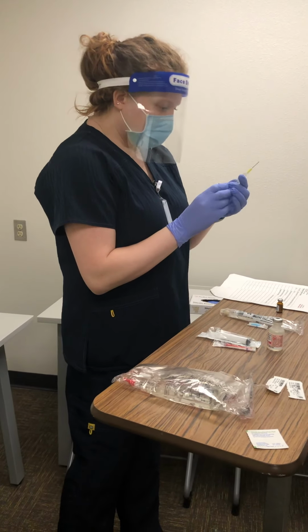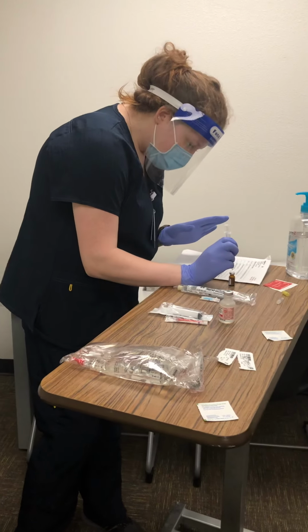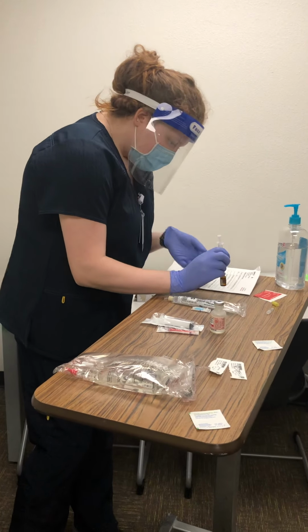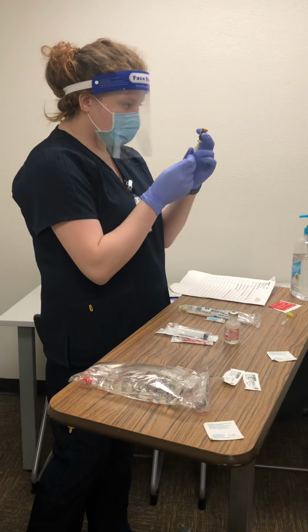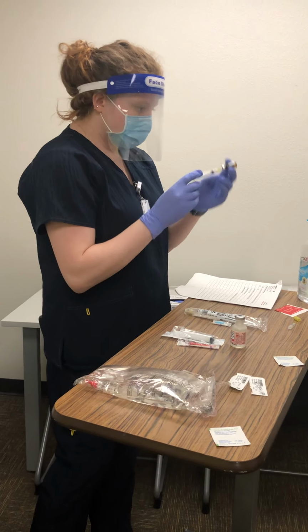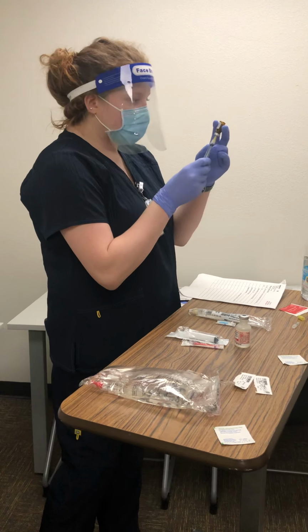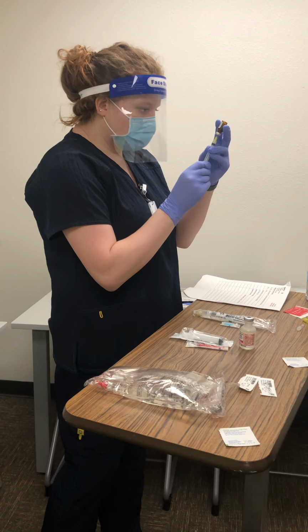So I'm going to pull out 0.4 mL of air. My hub is dry, so I am injecting in here, and I'm going to inject my air, and now I'm going to withdraw my 0.4.